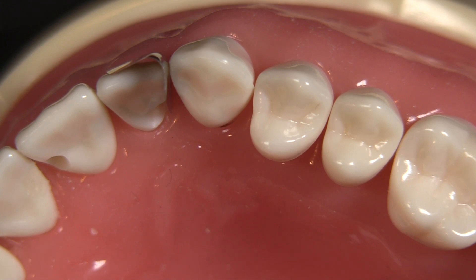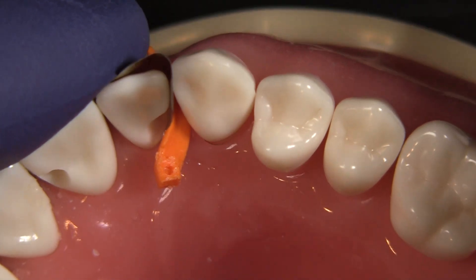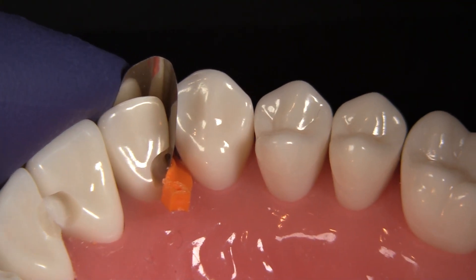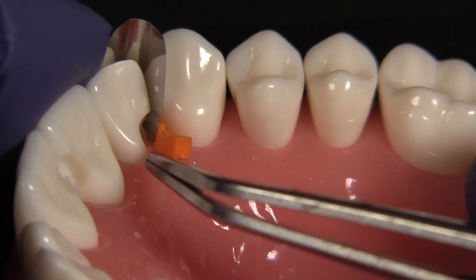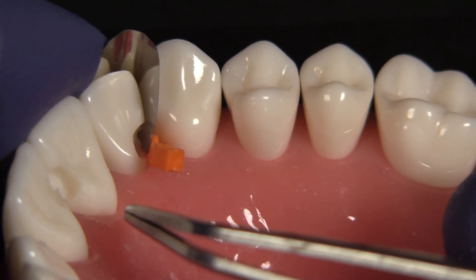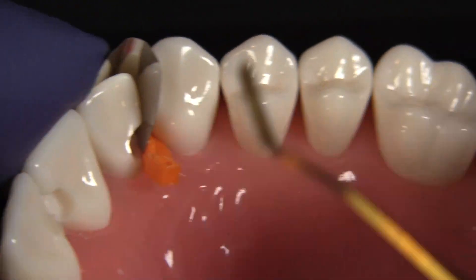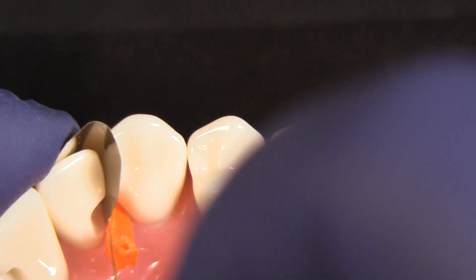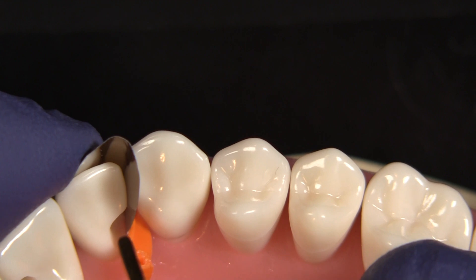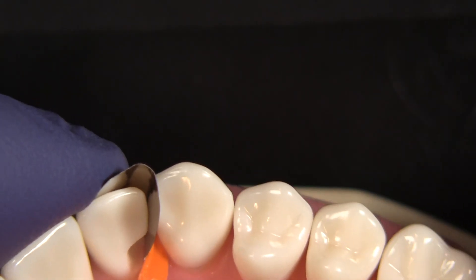It's a little tricky with this rubbery gingiva because it tends to want to push back more. But that's essentially what I would want it to look like. I'm fully sealed up against the tooth subgingivally. Now I still have to be able to get an instrument in here to shape that part of the prep as it wraps around towards the lingual — but I can do that. I can get that instrument in there and guide it right where I want it. Once I get it in the right spot, I'm going to pull this way, and same thing as I get down towards the wedge. That's going to lead to a nice curved restoration with minimal contouring. The most important thing is all of this in here is going to be nice and sealed and taken care of — no leakage.